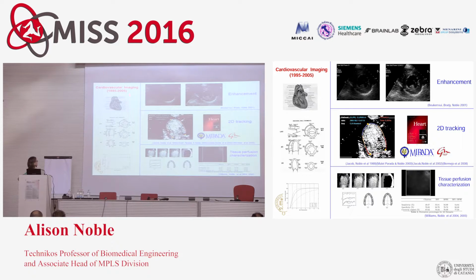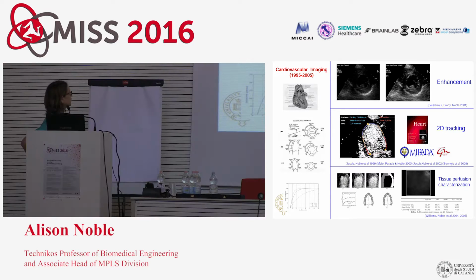In cardiovascular imaging, and this again was touched on by Nicola Ayash yesterday, the challenge there, if you're interested in looking at the heart, you focus on the chamber here, which is the left ventricle, and you focus on a characterization from the cardiologists of thinking about either characterizing the wall motion in what we call short axis scans, or through the 2-chamber, 4-chamber, and long axis.